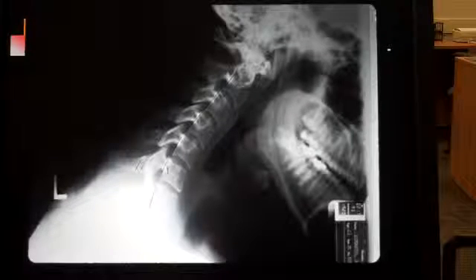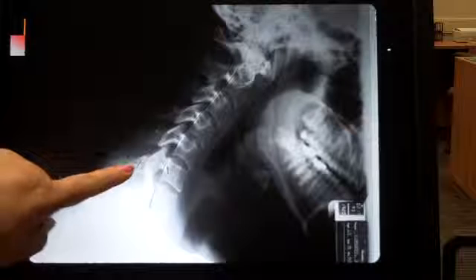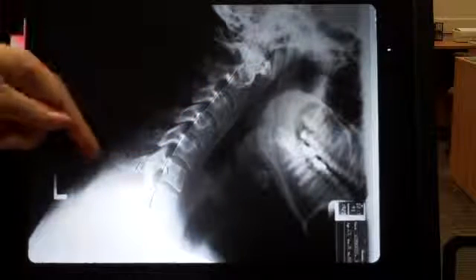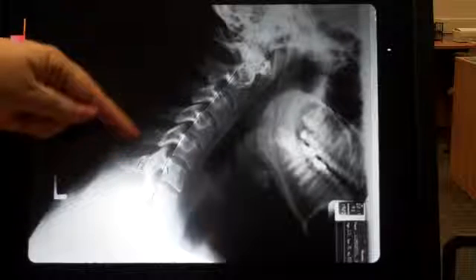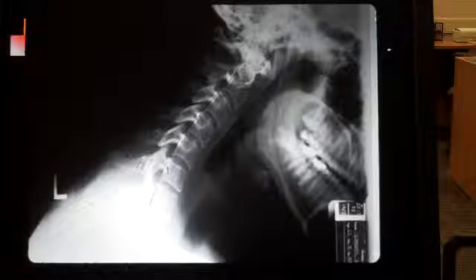So we are working on a lateral flexion view, and again, we have four things. We have George's line, we have the posterior cervical line, we have the ADI, and we have the interspinous spacing, where we want to see an equal gap between these spinous processes.